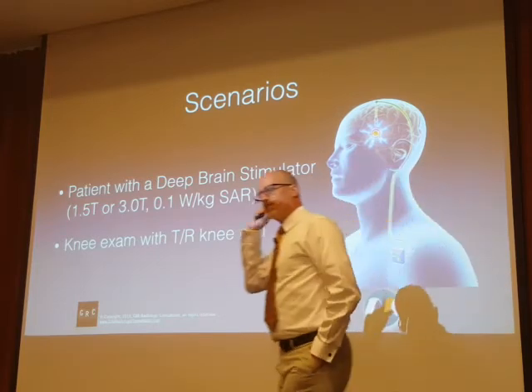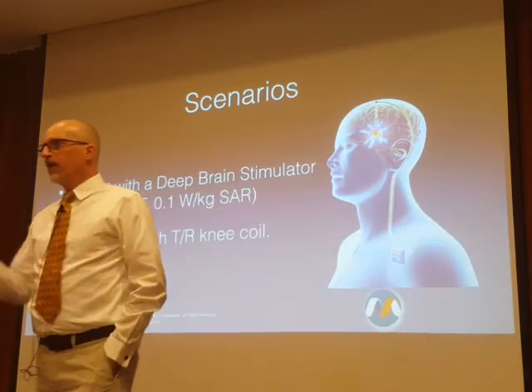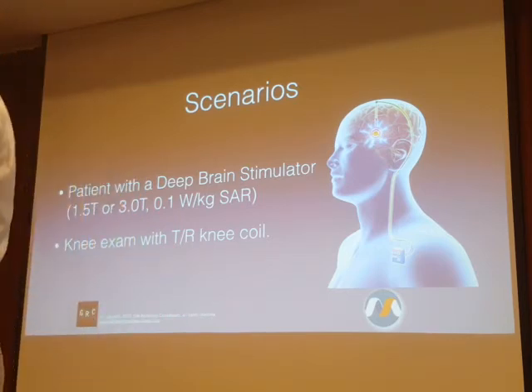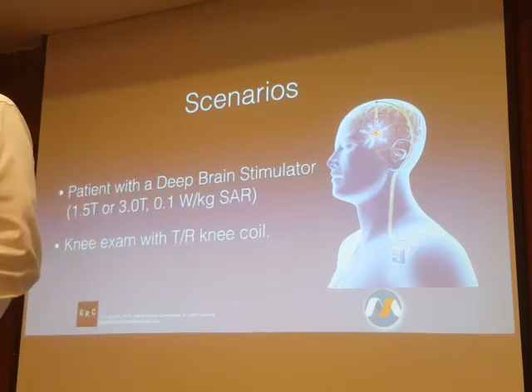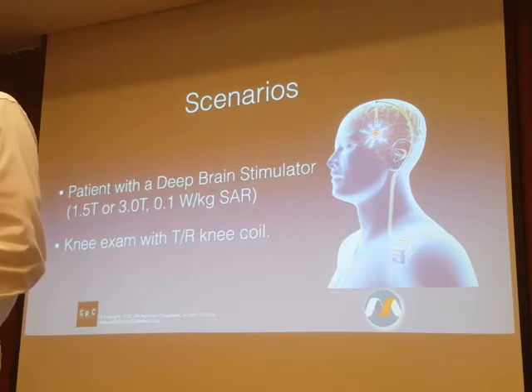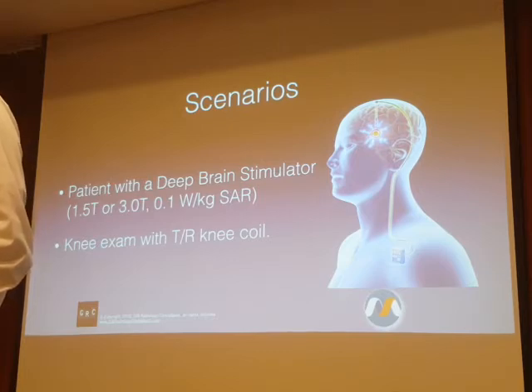Time varying gradients, I didn't put that up here as one of the conditions. If we're doing this patient's knee, would you be more concerned or less concerned than if we were doing their brain, specifically with time varying gradients and the potential to impact this implant? Less. Because once we're outside the face of the bore, time varying gradients are essentially zero.